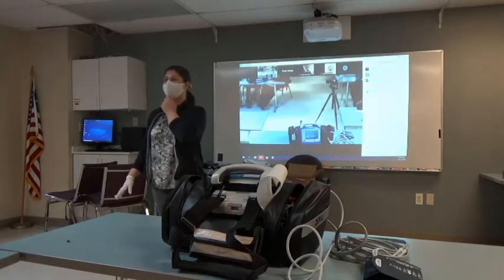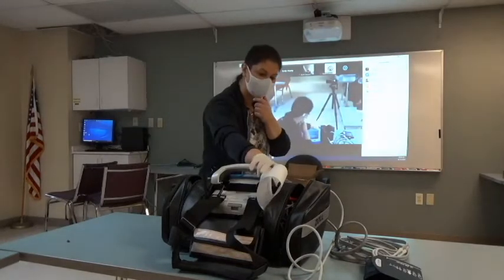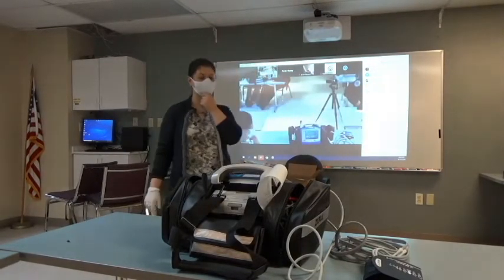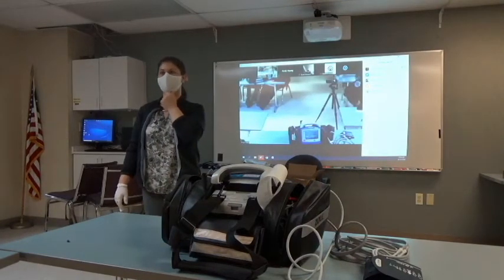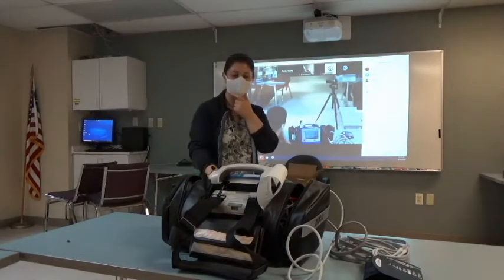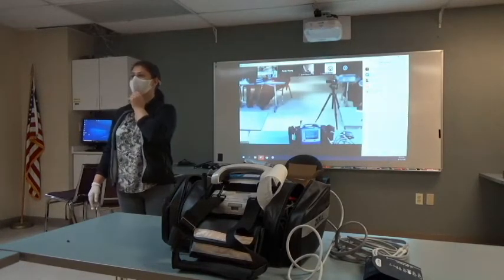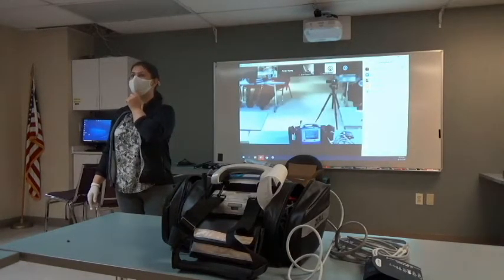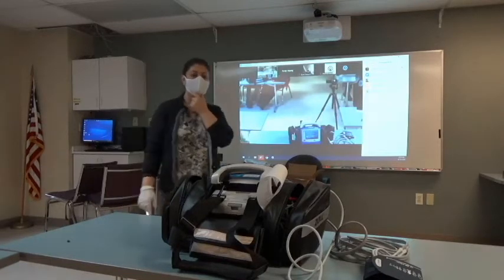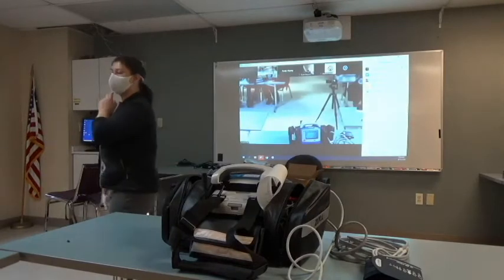That very first button, that's like that half-eaten cookie up at the top, this is your contrast. We're gonna skip the next couple of buttons. We're gonna go down to log. Is everybody over at log right now? Okay. The very first button push, that clipboard, is the entire call. That's your treatment summary.